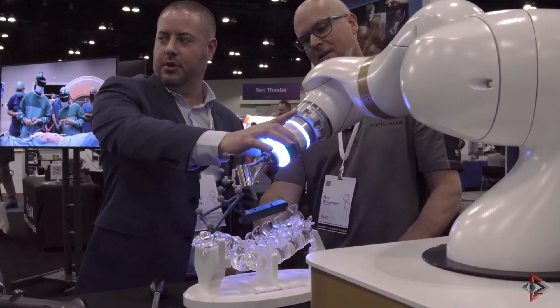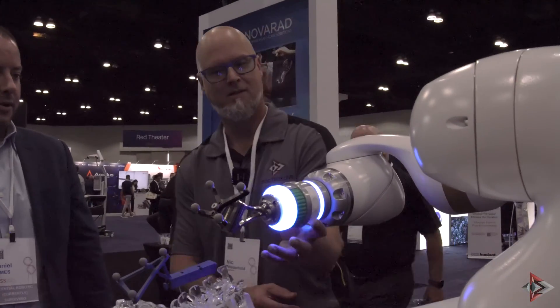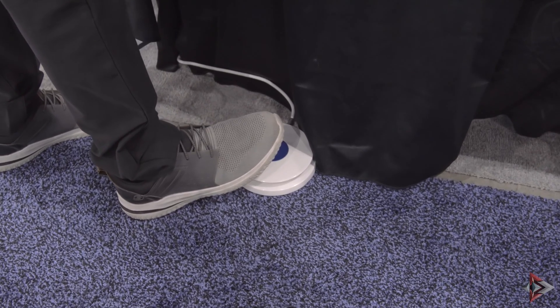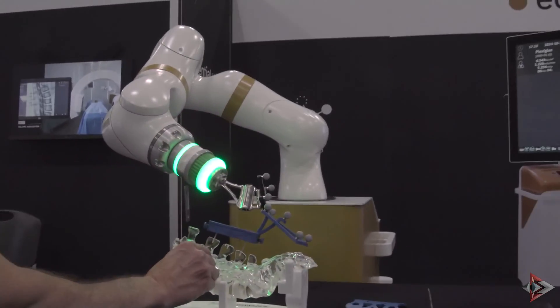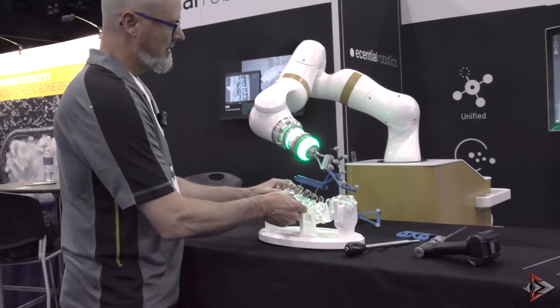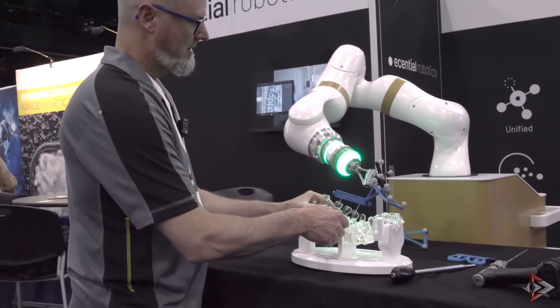Now you want to go over to the other side — double click. You can bring it over quick with one hand and then let the robot do the fine-tuning. Hold the green until it goes green, then foot on the switch. Hold the green again until you turn green, foot on and stay on — now you're using your instrumentation. If you were leaning on the patient and moved the entire patient, as long as it doesn't go too far or too fast, it's going to track it. That's going to save so many surgical techs and PAs from getting yelled at by a surgeon.